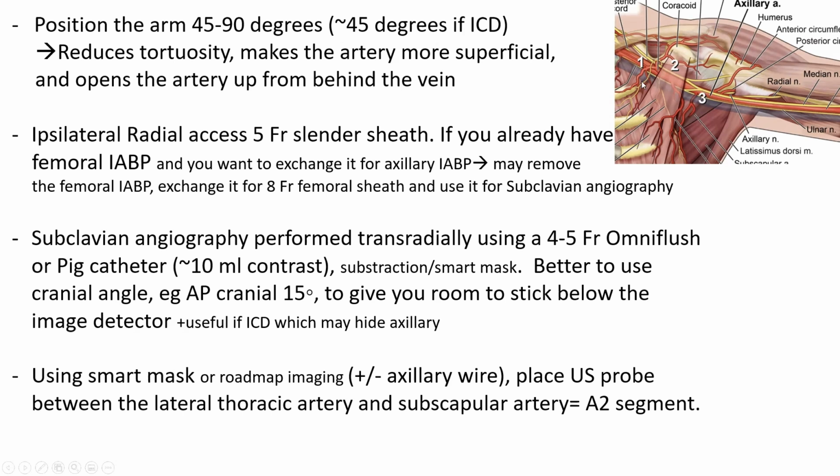If you have an ICD, I wouldn't do 90 degree. When you have an ICD, if you open up the arm 90 degree, the ICD will abut the clavicle and it will move more laterally and it will give you little room to stick A2. It's already hard to stick A2 in an ICD patient. You may end up having to go too laterally. So I try to keep it around 45 degree in ICD patients.